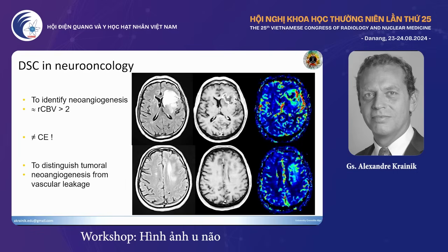Normally, when you don't have any lesion of the blood-brain barrier, your brain parenchyma won't enhance, contrary to your muscle, your kidney, your liver, or thyroid, or whatever. When you inject contrast media, the organ enhances. It works for everything except for the brain, because of this blood-brain barrier.